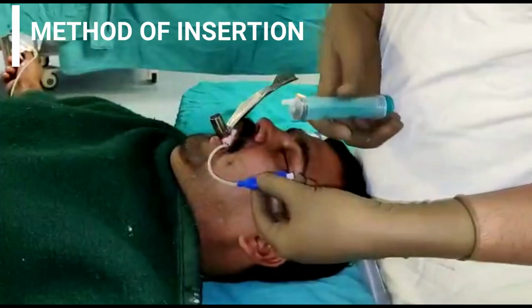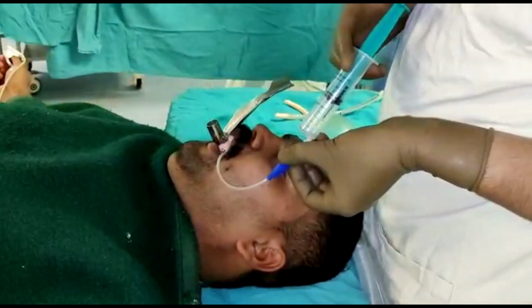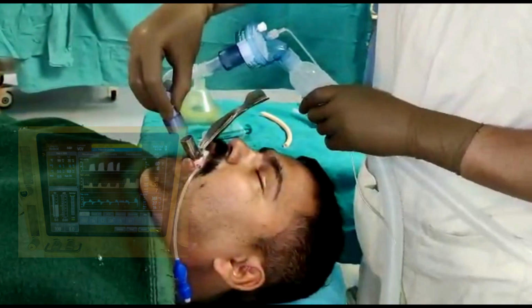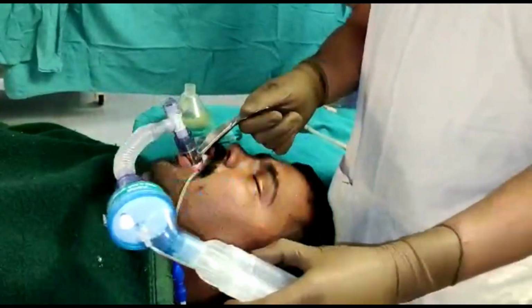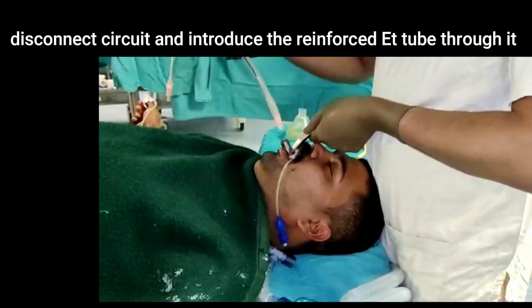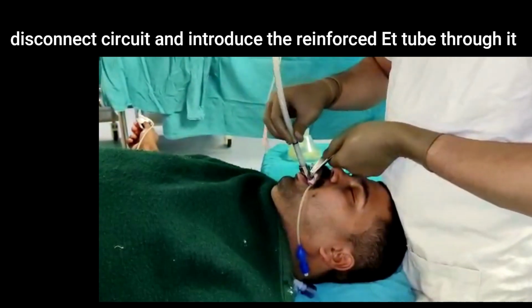Confirmation is by attaching the closed circuit and seeing the ETCO2 capnography. Disconnect the circuit and introduce the reinforced ET tube through it. Insert the tube till the horizontal black mark is seen. Attach the monitor and see the ETCO2.